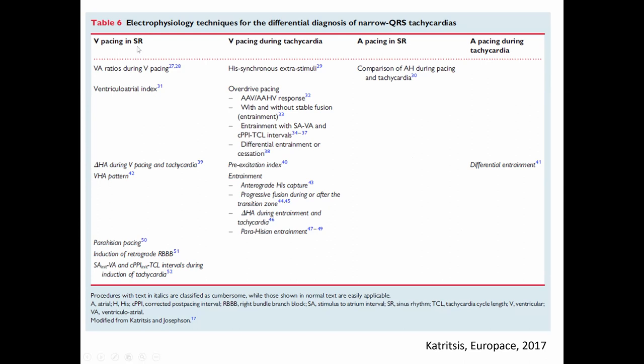I guess you've got ventricular pacing maneuvers you can do in sinus rhythm or in tachycardia, and atrial pacing you can do in sinus rhythm or tachycardia. We're really just going to focus on a couple of things. We've already spoken about overdrive pacing and the response post-pacing, the post-pacing interval and tachycardia cycle length. The other thing we should talk about, and I'll show you an example of, is putting in His synchronous extra stimuli. And we'll also talk about atrial entrainment.